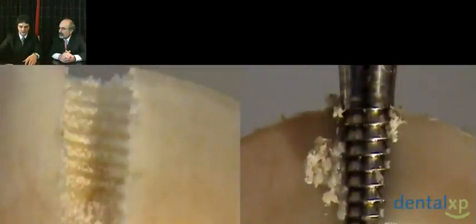So we have to understand that micromotion is also related to the bone density, of course. If the implant is placed in low density bone, or in a high and strong compact bone at the cortical level, immediately after placement, if you do the right preparation of the bone site, you can achieve a very strong immediate connection to the perimplant bone. That is almost equivalent to osseointegration.